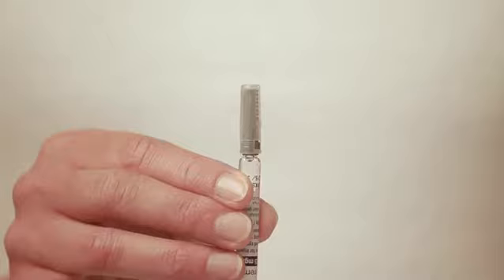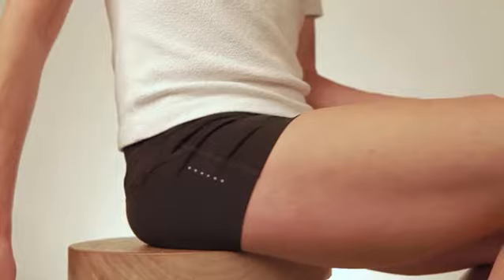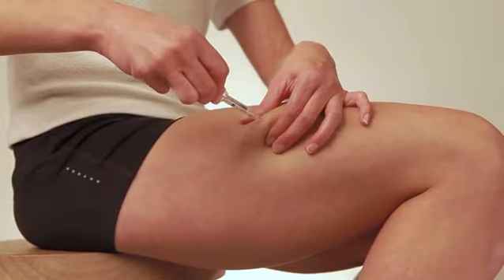Remove the protective cap from the needle. Take a thick skin fold, preferably on your thigh, between your thumb and index finger. Use your other hand to inject the needle at the base of the skin fold at an angle of 45 degrees to the surface of the skin.